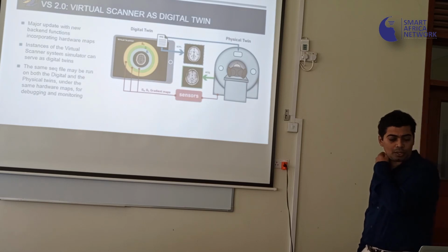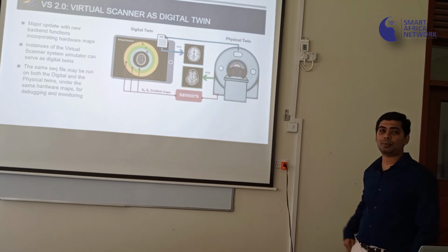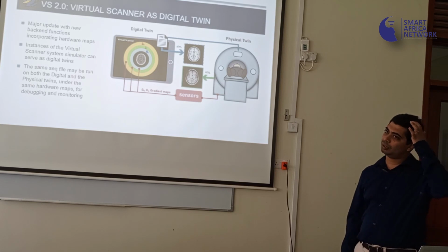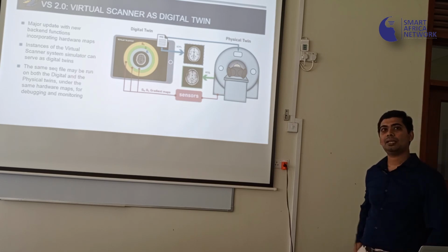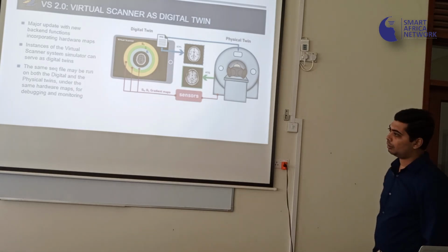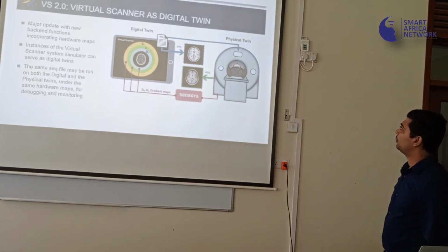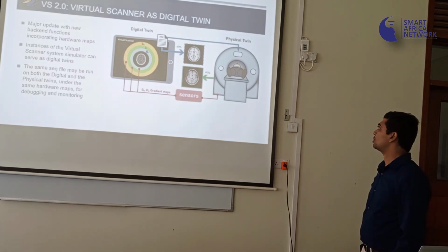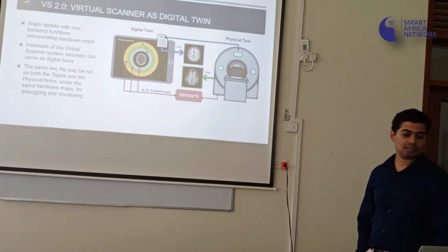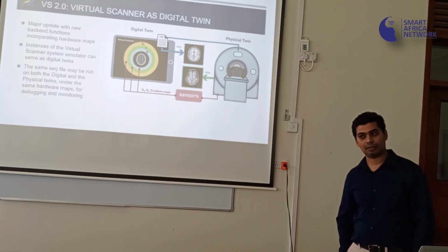In virtual scanner 2.0, we've taken this one step forward. What we've done is to say, okay, I'm producing this bunch of simulations all on the computer. Does it actually work in the real world, and does it make sense to form a closed loop between the virtual world and the physical world? So we've integrated the digital twin, using this virtual scanner, with the physical twin, which is the MR scanner. So you do these experiments in your lab, then you want to move it and see whether it makes sense on the real scanner.